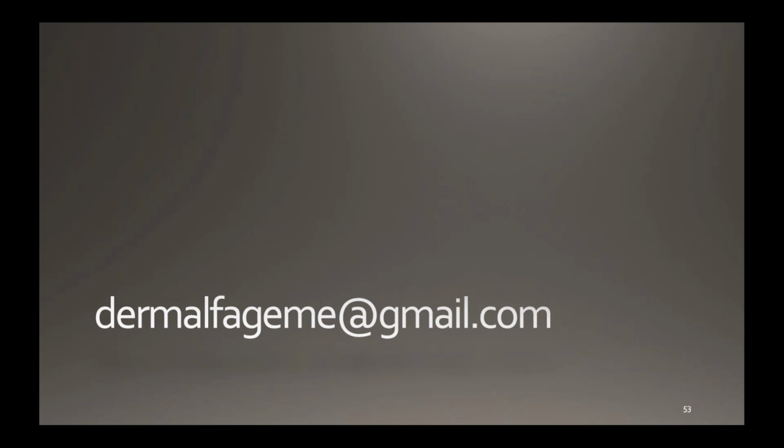Because of two things. First, making this kind of images available for everyone is a useful educational resource. And two, thinking about future artificial intelligence ultrasound diagnostic methods, it can be very good for big data in cases in which we are not very sure about the diagnosis of the patient, and the implementation of artificial intelligence regarding this kind of images can be good. Then there is no registry. We must do it. It's a very good suggestion.